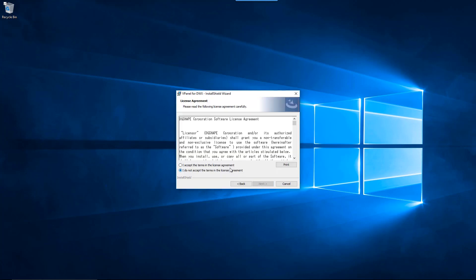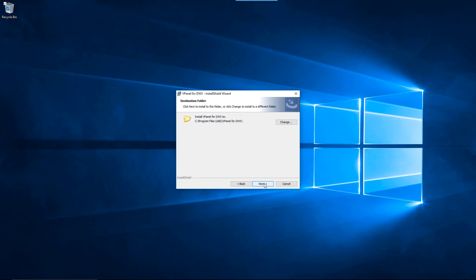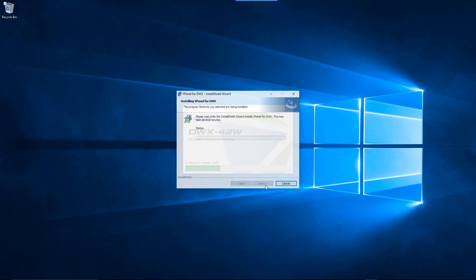Review the Terms and Conditions. If you accept the Terms and Conditions, click on the I Accept button, then click the Next button to proceed. When the InstallShield wizard is displayed, click the Install button to start the installation process for the vPanel software.